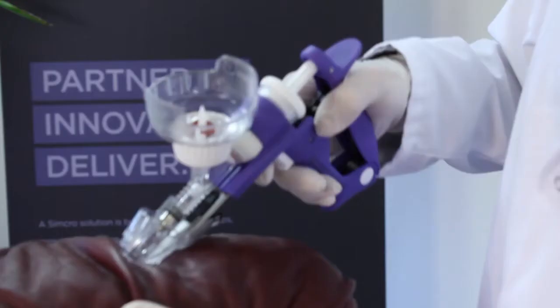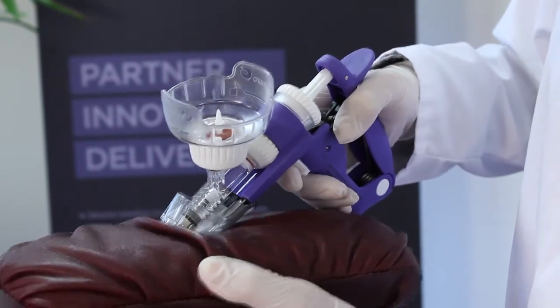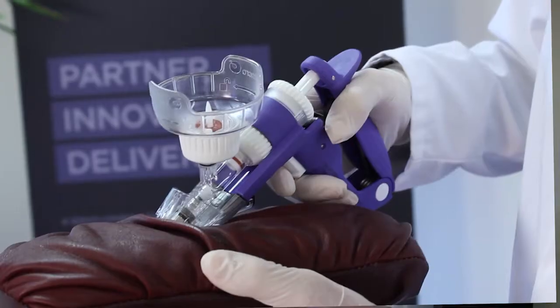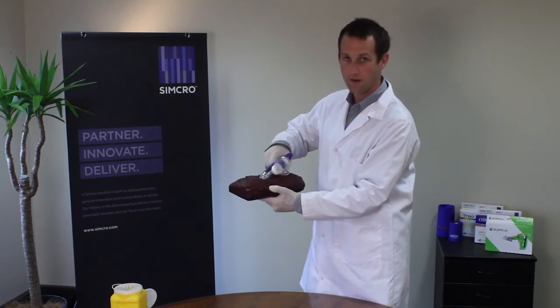Approach the animal and as we grab the hide you'll notice the needle guard is retracted. Once that is fully retracted and the needle is fully engaged in the animal, then we can inject. So it's one, two, three.